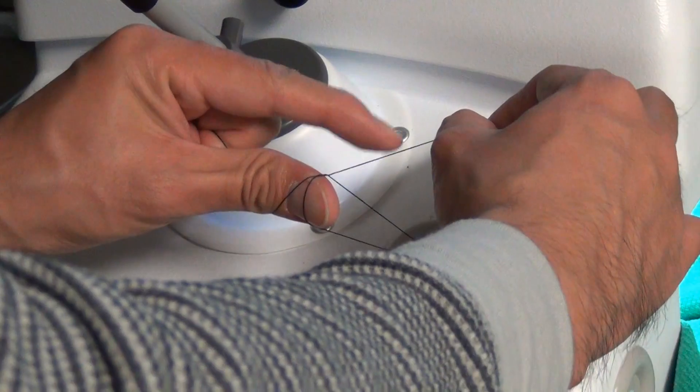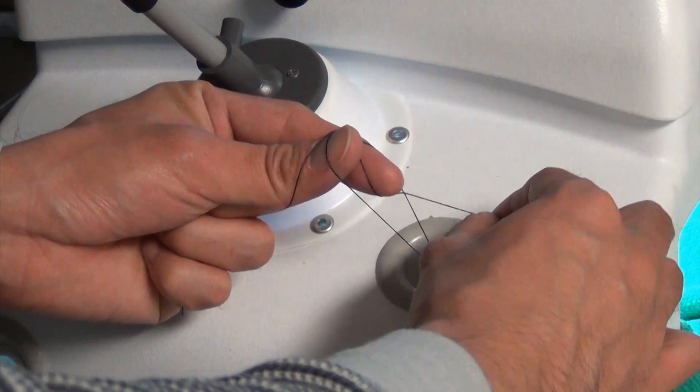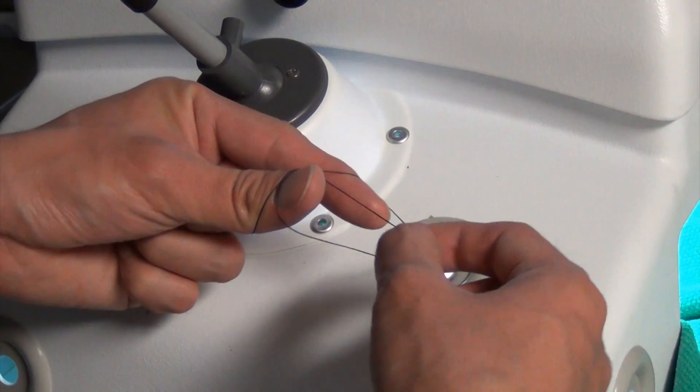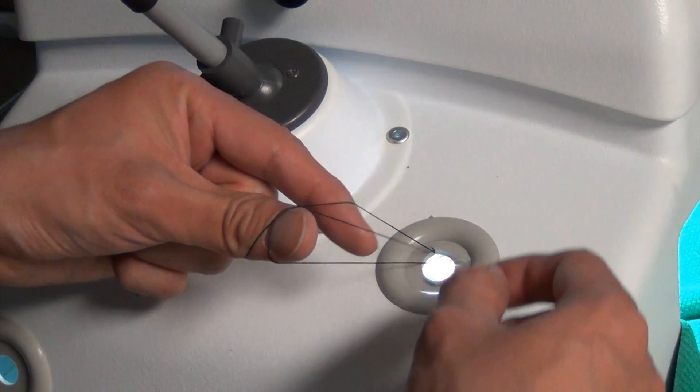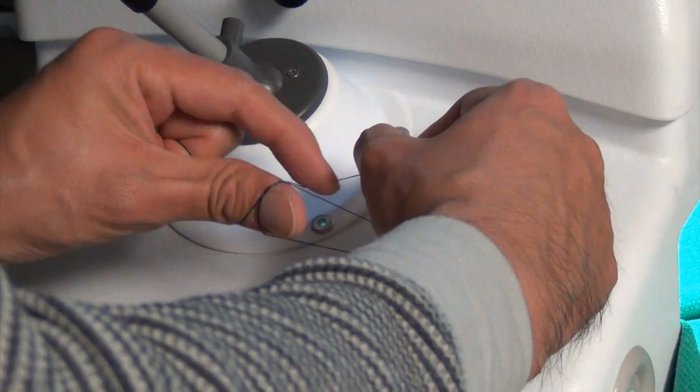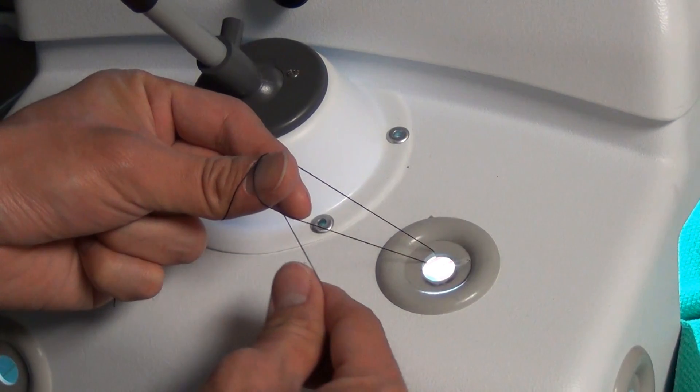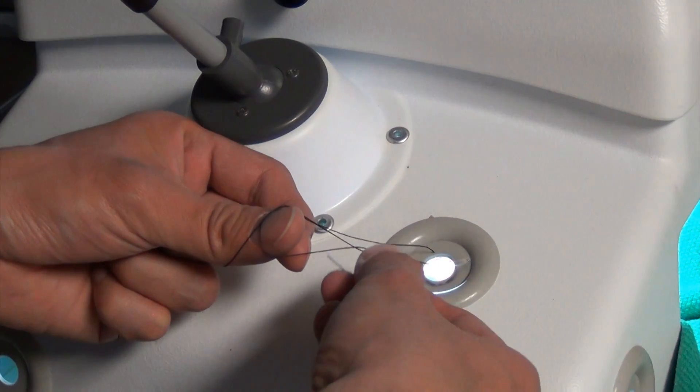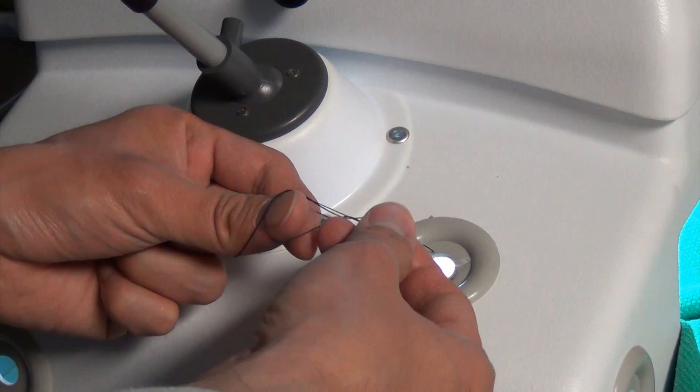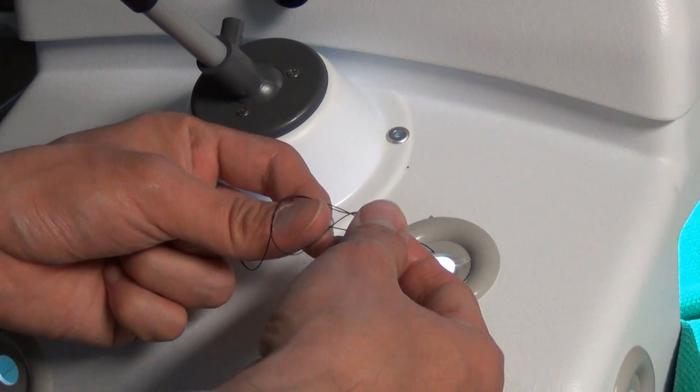Repeat the process of bringing the tail end of the suture around the other end of the suture. Bring the tail end of the suture around the needle end of the suture, but also wrap the tail end of the suture around itself. Bring the end of the suture through the hole formed by the suture near the thumb.